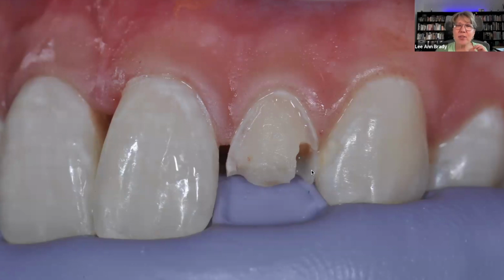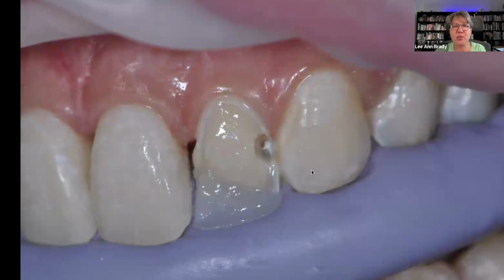Okay. But the first layer, I've got my silicone matrix. This one happened to have been made off of a model we did a little waxing on, because I didn't have a pre-op model since it was a trauma. And the first layer we put in there is the lingual. And notice I've put the lingual where that through-and-through class 3 was. I've put the lingual all where that entire class 4 fracture was. And now this layer is light cured.